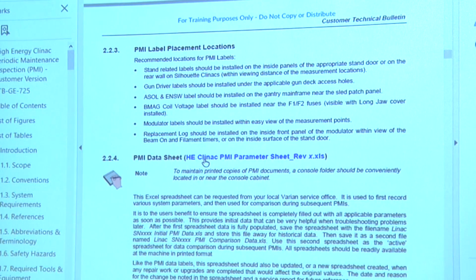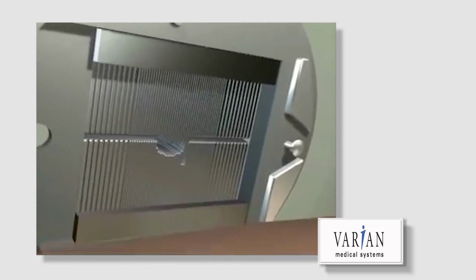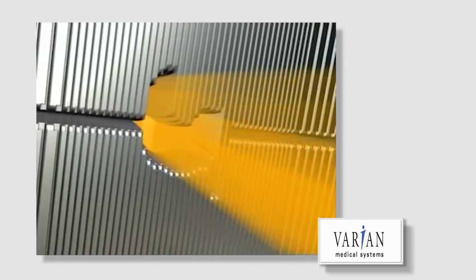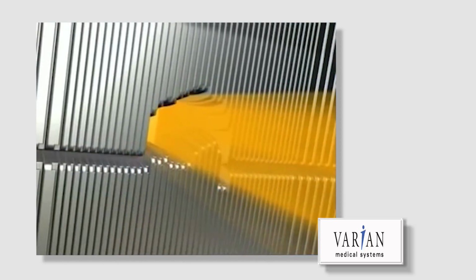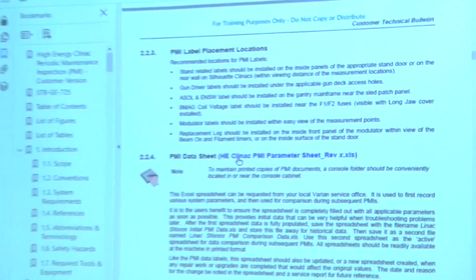Why an older system might seem like it's down a lot more: it's because it's wearing out. And it'll get to the point where you start doing refurbishments. You'll replace cable harnesses, major components. Your MLC, the Varian system, has 122 motors if it's a Millennium MLC. And all the electronics in there, that's the area of the most intense radiation, right in your collimator area. So that's why we're going to go through replacing some MLC motors.